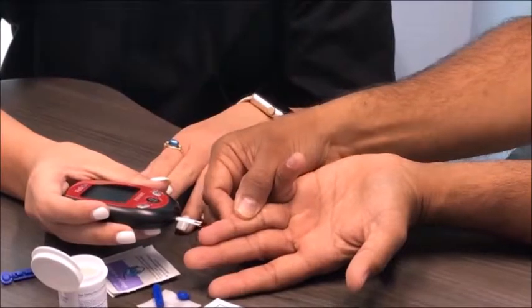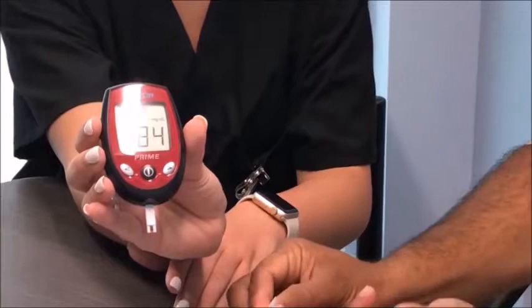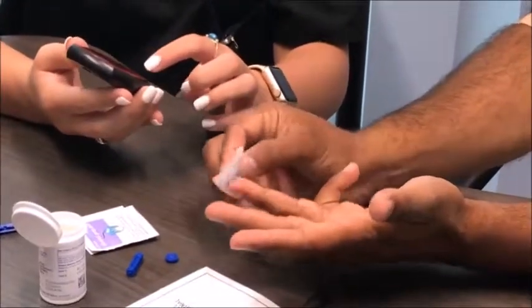It's reading. All right, and now we have a reading. Okay. And you can just wipe your finger off. And then we would record this in your logbook.